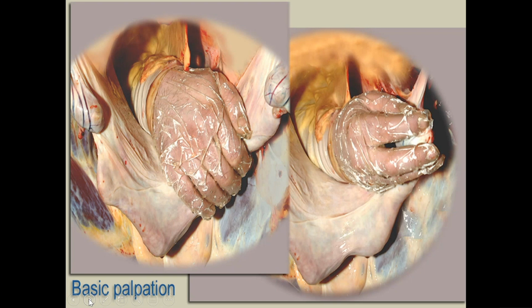The second reason is that certainly myself and I think most clinicians, as we're doing the rectal palpation, will make a decision about what it is we think we're feeling. Are we feeling a 35 millimeter follicle? Are we thinking it's a corpus luteum? Are we detecting tone in the uterus? And obviously these palpation aspects of the examination aren't available simply from the ultrasound.